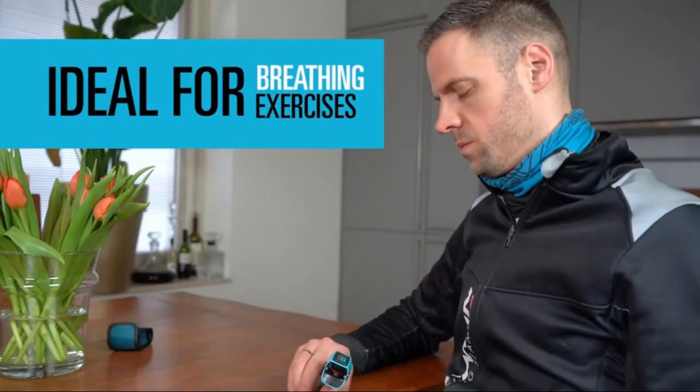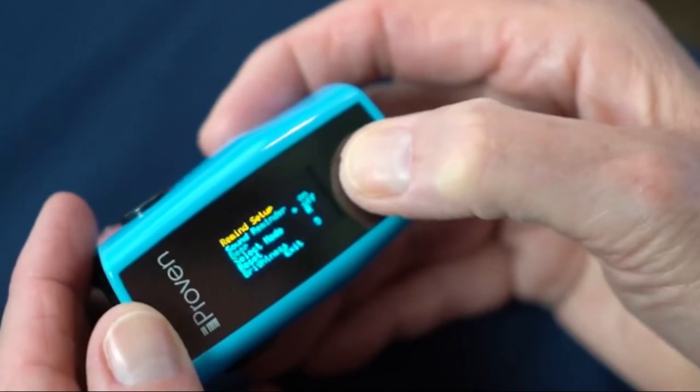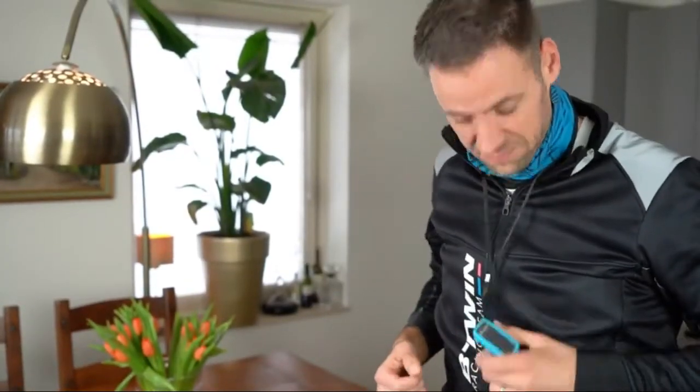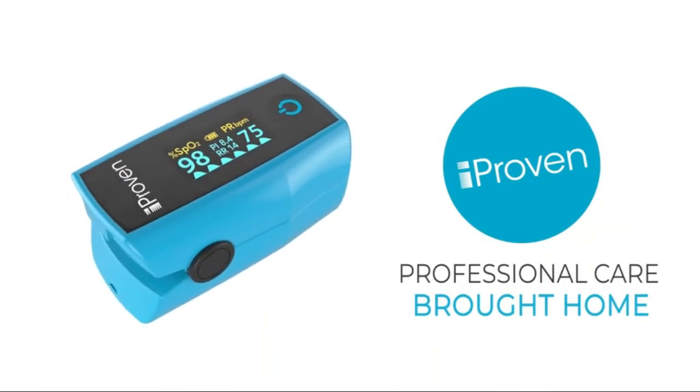Your results update in real time. Unique respiratory rate (RR) feature: the oximeter counts your breaths per minute and updates in real time. Use the RR to improve your breathing exercises and help you relax. Perfusion index and plethysmograph: the pulse oximeter measures the blood pulse.